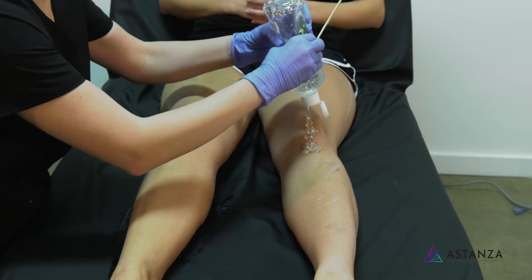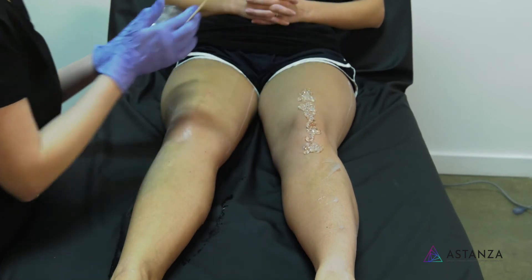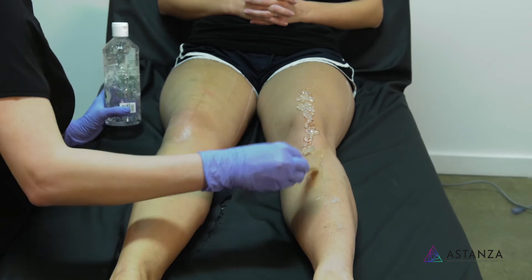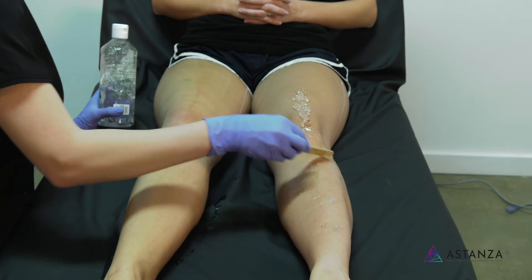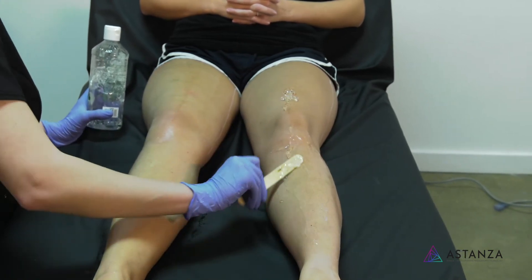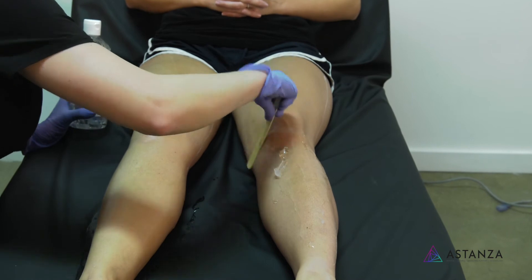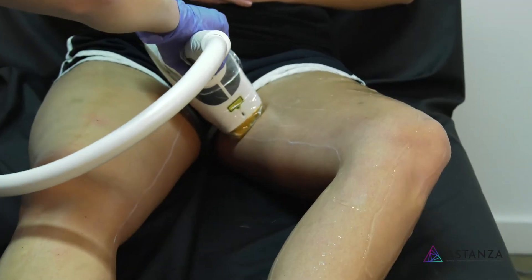How many sessions does it normally take? It really depends on the person and genetics. It could be five sessions, maybe even up to eight — it just really depends on your body. Also, if people are on any sort of hormones, or pregnancy can change hair growth. All kinds of stuff like that.